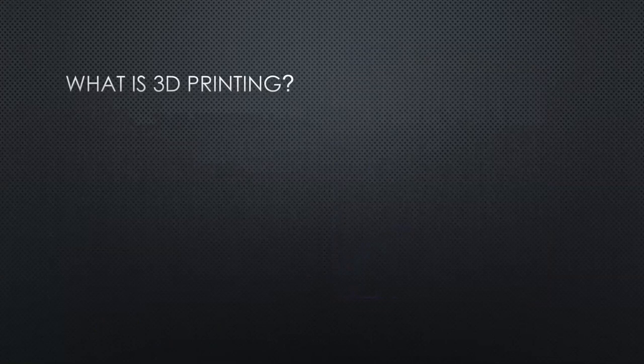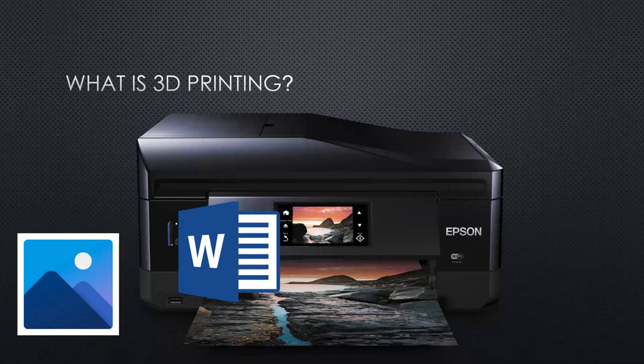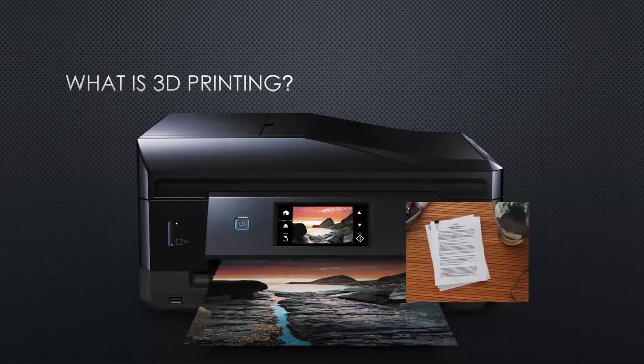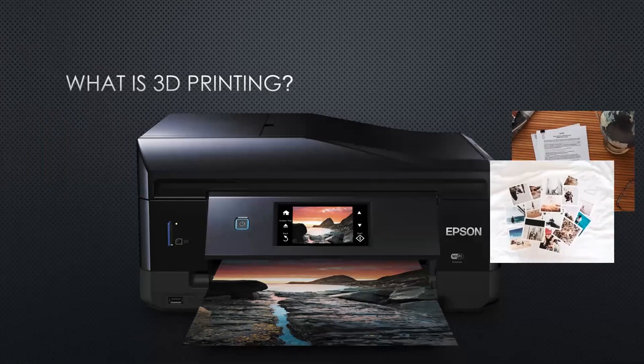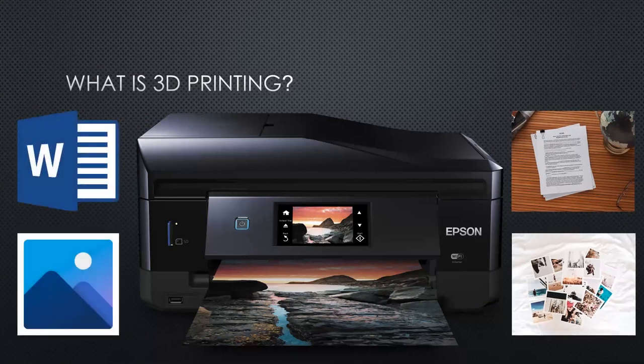So the first question we need to ask, of course, is what is 3D printing? Well, let's take a step backwards and look at traditional two-dimensional printing. Everyone knows what this is, I hope. It's a regular paper printer that you connect to your computer. And I sincerely hope that everyone knows how it works, but just in case you don't, you have either a document or a photo on your computer that's sent to your printer, and it uses either ink or toner to produce a letter or photograph. So this printer works by depositing ink or toner in a flat two-dimensional layer, and the end result is a physical real-world representation on paper of what you had created on your computer.